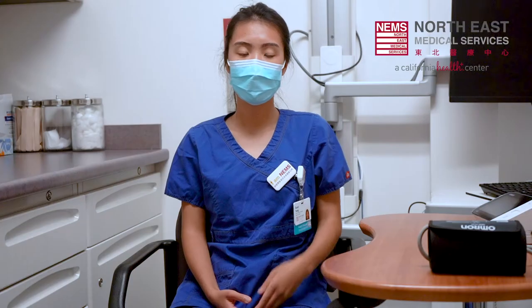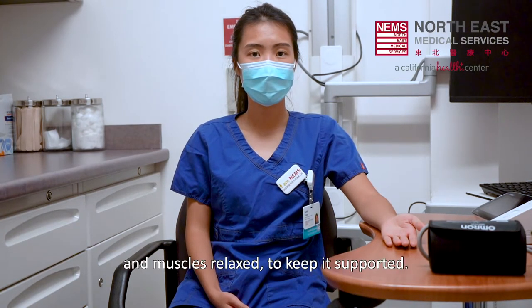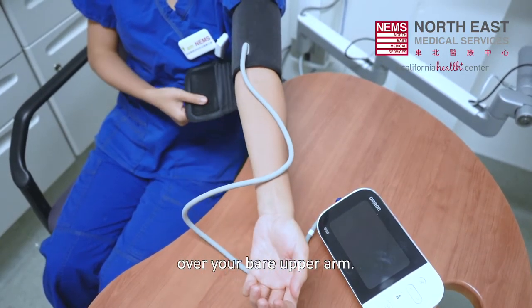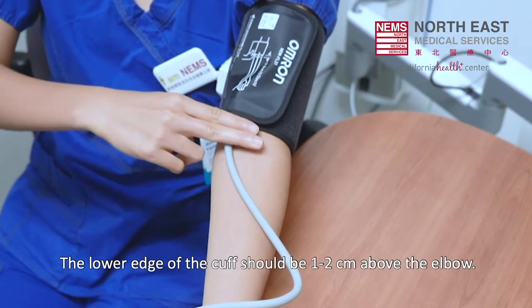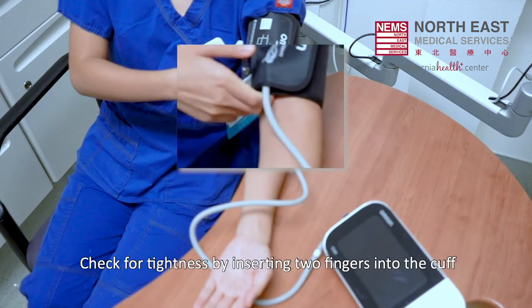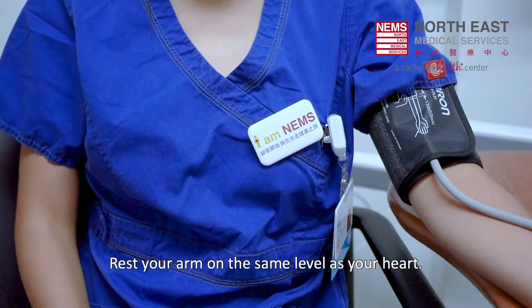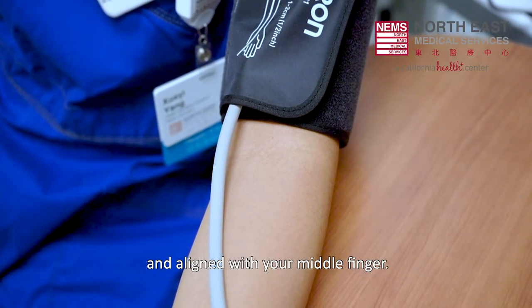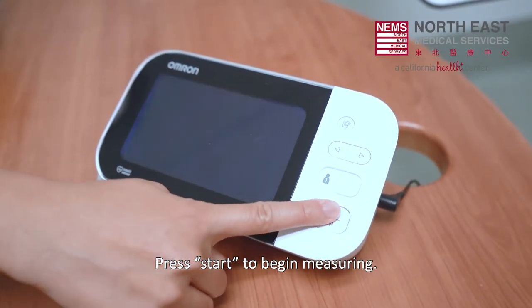Do not cross your legs. Rest your arm on a surface with palm facing up and muscles relaxed to keep it supported. Wrap the cuff snugly over your bare upper arm. Avoid clothing that may constrict blood flow. The lower edge of the cuff should be 1-2 cm above the elbow. Check for tightness by inserting two fingers into the cuff and adjust if needed. Rest your arm on the same level as your heart. Make sure the air tube is pointed down and aligned with your middle finger. Keep elbows straight and avoid bending. Press start to begin measuring.